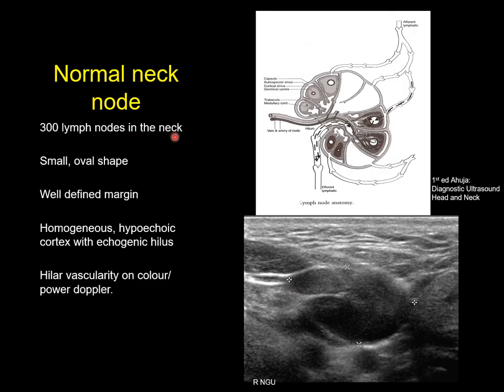There are 300 lymph nodes in the neck. A normal lymph node should be very similar to what you see on histology — it should be oval in shape. It should have an echogenic hilum, as you can see here, and there should be a blood vessel through the hilum. Normally you'll find it through here as well if you apply colour and power Doppler. The cortex itself should be homogeneous, well defined, small in size, and oval in shape.